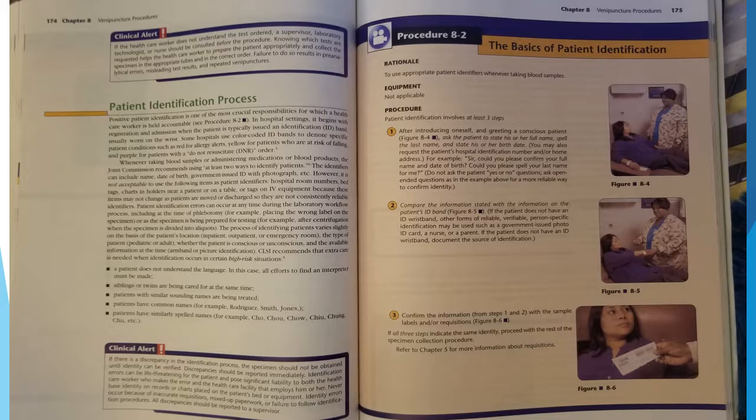Clinical alert. If the healthcare worker does not understand the test ordered, a supervisor, laboratory technologist, or nurse should be consulted before the procedure. Knowing which tests are requested helps the healthcare worker to prepare the patient appropriately and collect the specimen in the appropriate tubes and in the correct order. Failure to do so results in pre-analytical errors, misleading test results, and repeated venipunctures.